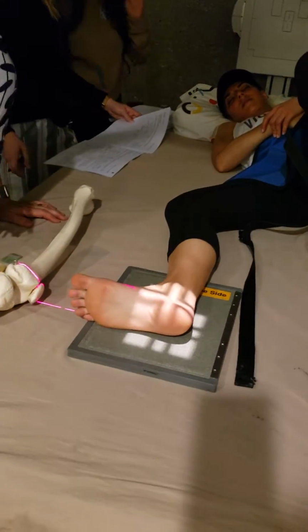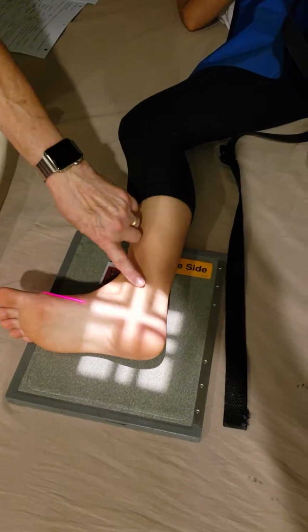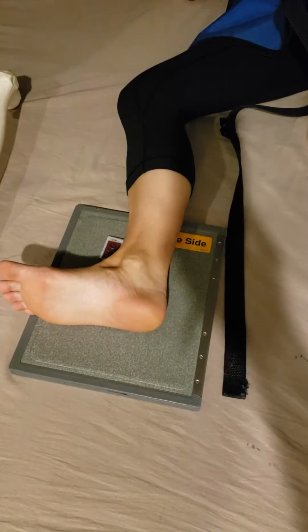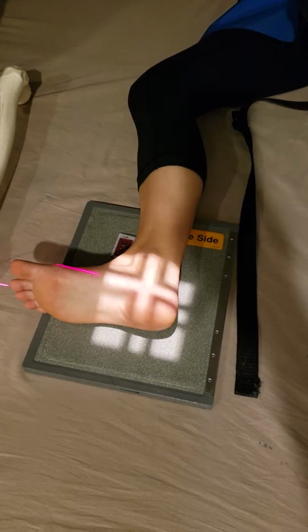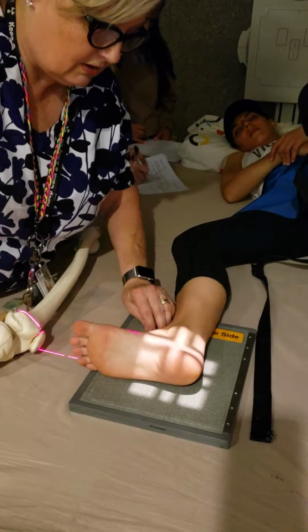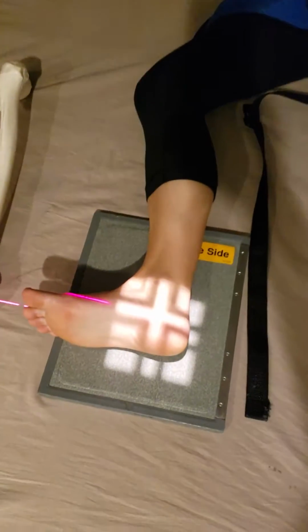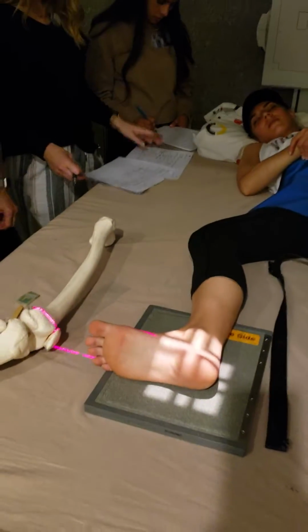Calcaneus. Boom. So now the top light's hitting right at the malleolus, and the front of the light's at the same place, right where the tarsal metatarsal space is. And then my marker, I would just sneak in here in the corner, up in that upper corner. Okay?